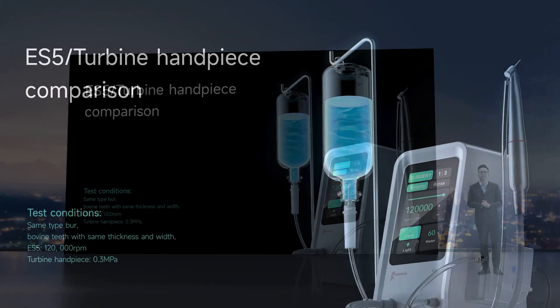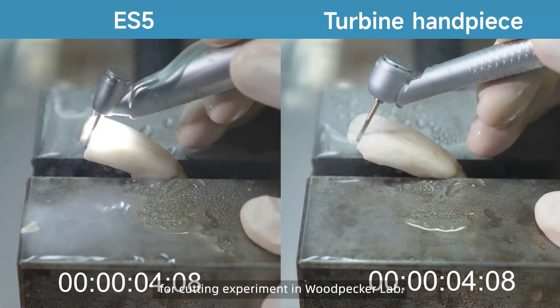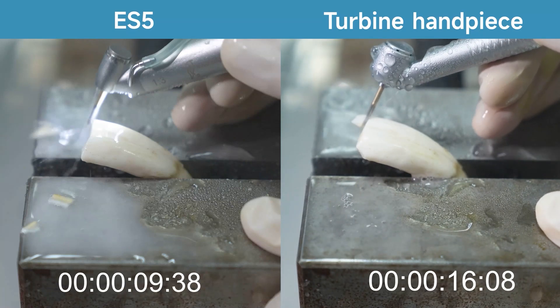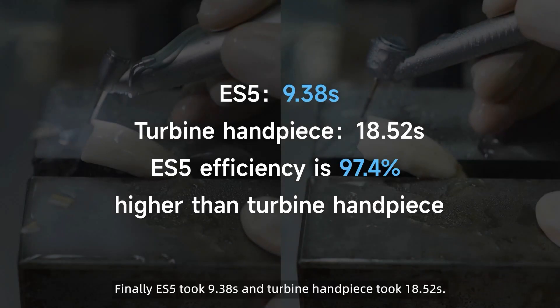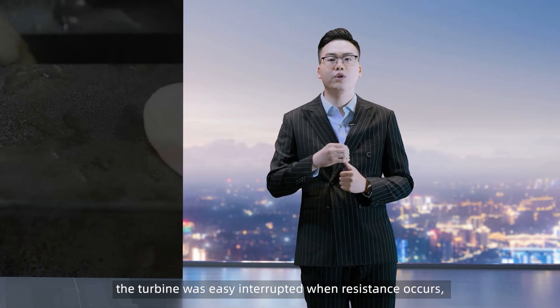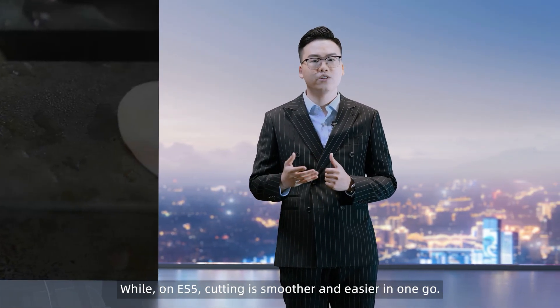Let's check the comparison video. We use the same burr, the same width, and the same thickness of bull teeth for a cutting experiment in the Woodpecker lab. ES5 was set to 120,000 RPM and the turbine handpiece was adjusted to 0.3 MPa air pressure for comparison. Finally, ES5 took 9.38 seconds and the turbine handpiece took 18.52 seconds. The efficiency of ES5 was 97.4% higher than the turbine handpiece. During the operation, we also found that the turbine was easily interrupted when resistance occurred, requiring more experience from doctors. While on ES5, cutting is smoother and easier in one go.